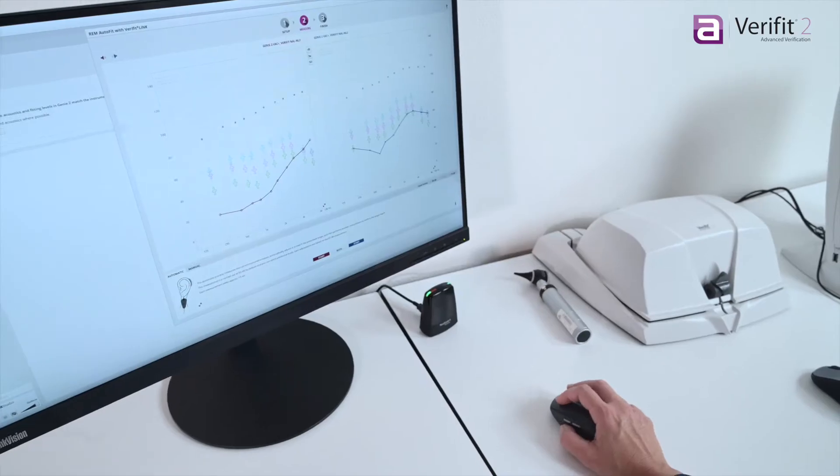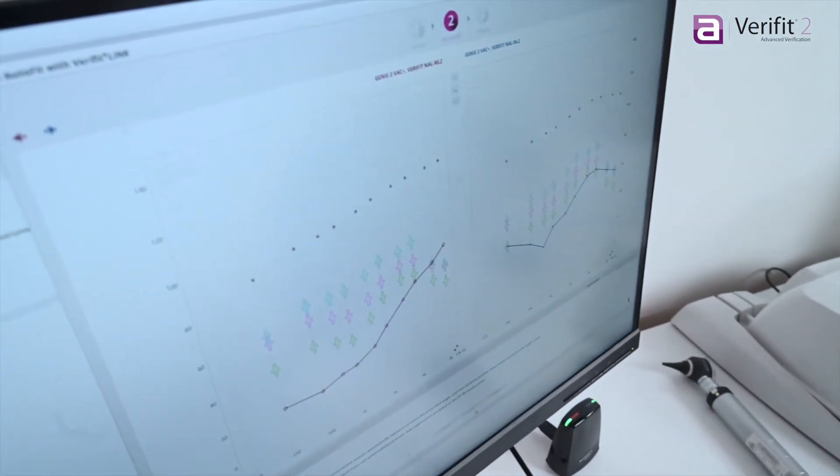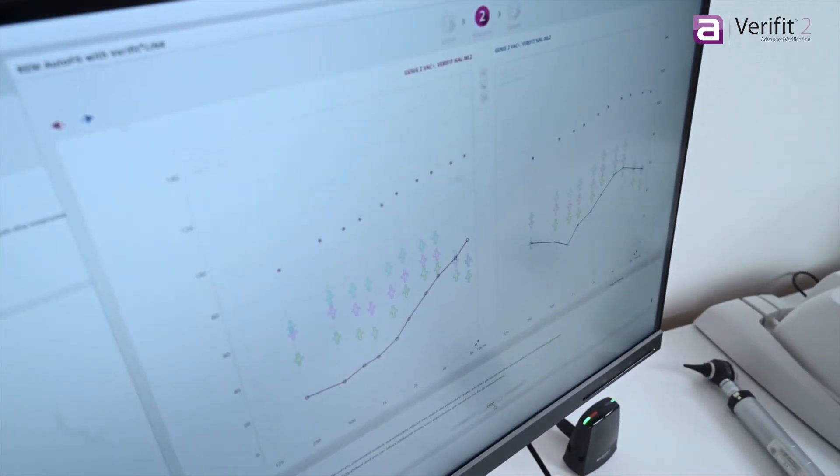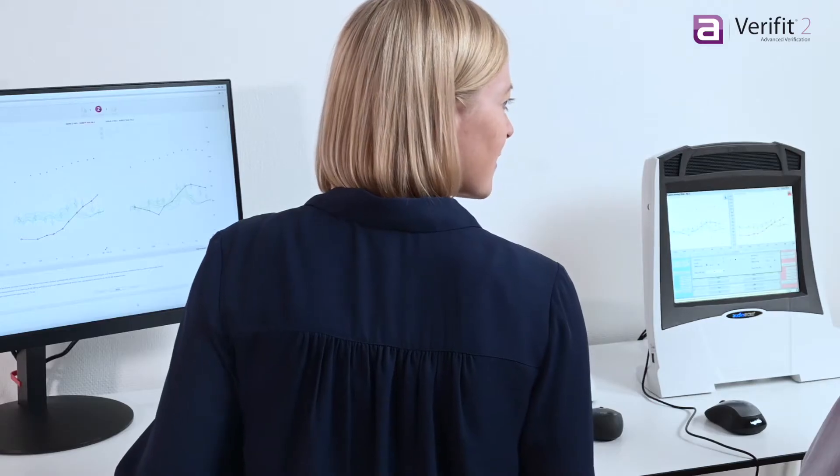VerifitLink automatically verifies and adjusts the client's hearing instruments to target through a direct connection to the fitting software. You save time and ensure best practice verification for each fitting.